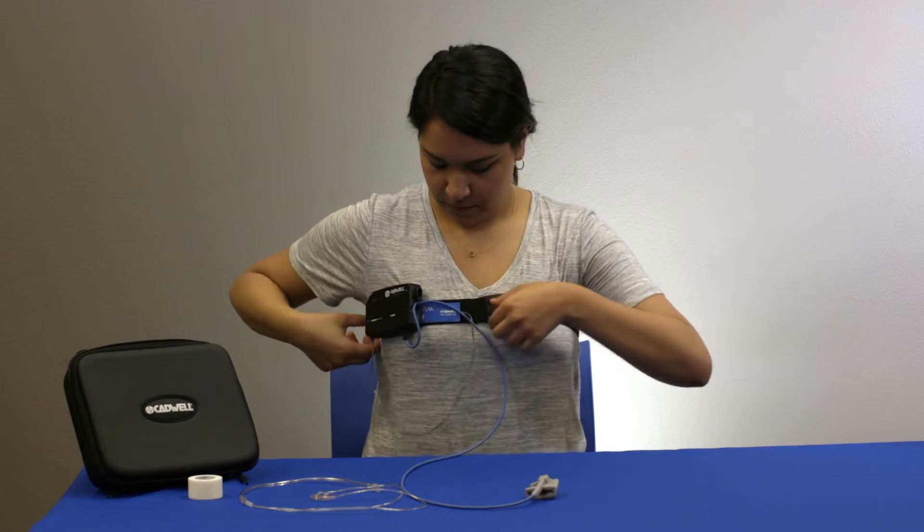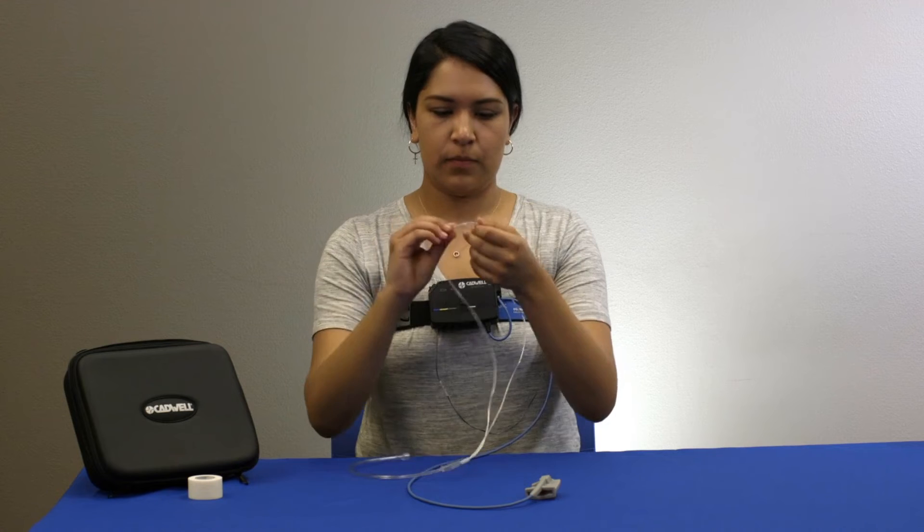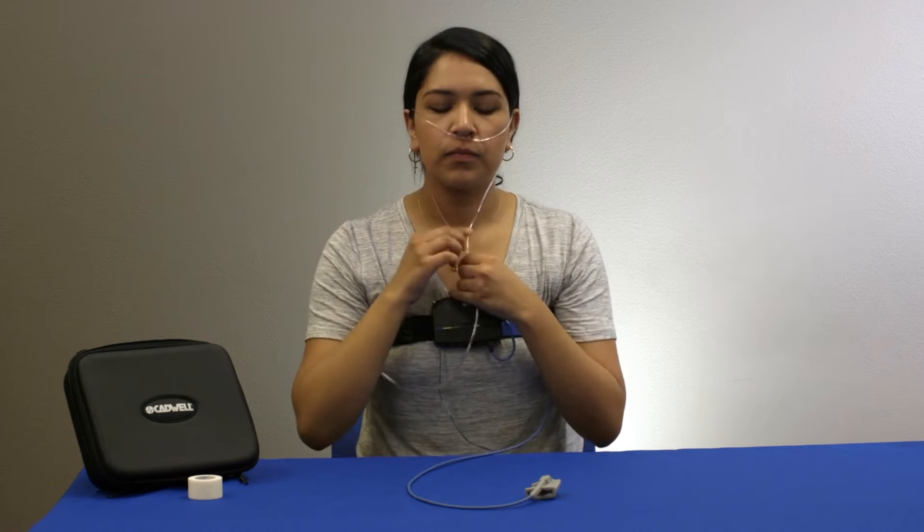Holding the cannula with the prongs facing towards you and curving down, insert the ends of the prongs into your nose and pull the cannula tube back over your ears like a pair of glasses.